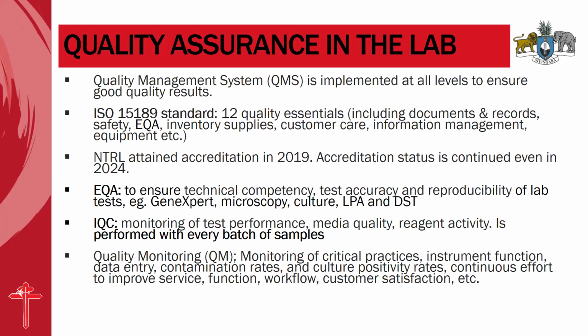Then the NTRL attained accreditation to ISO 15189 in 2019. The accreditation status is continued even in 2024, so it is still valid. The EQA also is a way of ensuring quality. So what is the importance of EQA? It is to ensure the technical competence, the test accuracy, and the reproducibility of the lab test. For example, it can be GeneXpert, microscopy, culture, LPA. So the EQA plays this role.